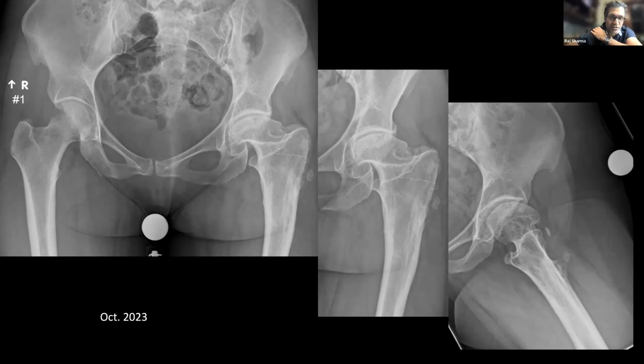I have a series of these as well, but I do this through a DA approach. Last time's the easy side. I agree with everything that Gavin's already said. The lateral is the most important view here for me, just because there's not too much in terms of changes in the femoral shaft on the lateral.